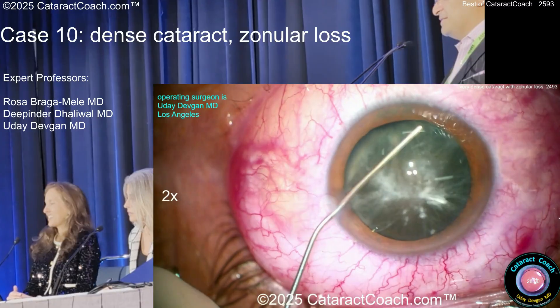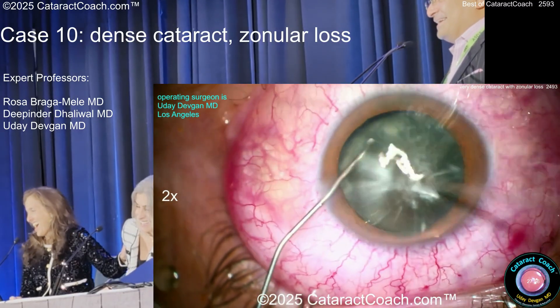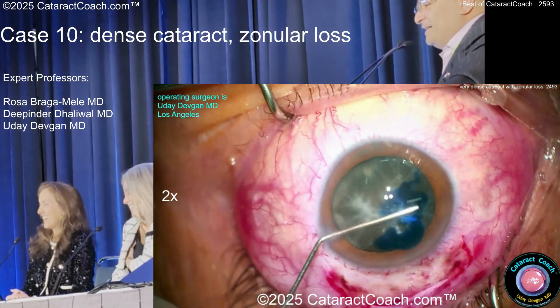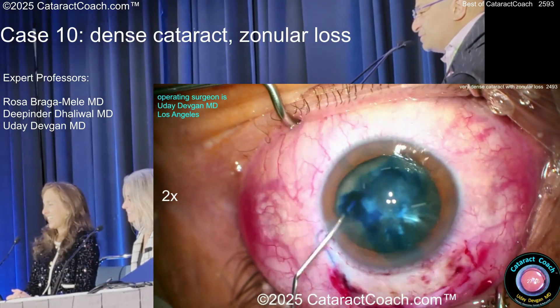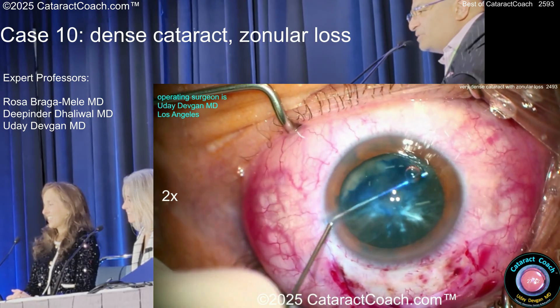Following that advice — that's the whole case. Very, very little trypan because I don't want it going back into the vitreous. Just put a little bit, kind of rub it around, and help loosen up the zonules a little more.